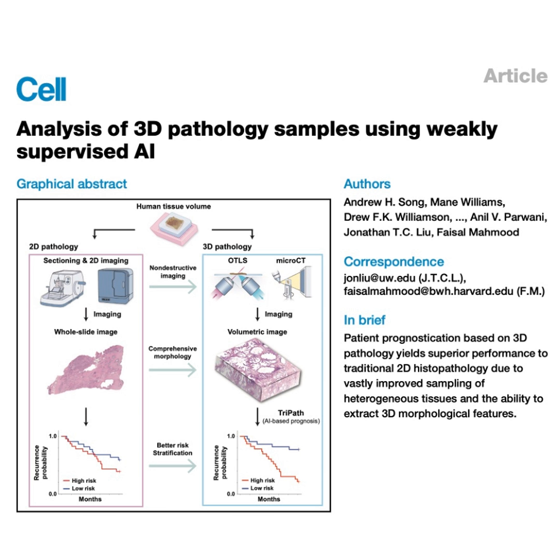Precisely. The attention mechanism automatically learns to assign an importance weight or attention score to each patch. Patches that contain features strongly indicative of recurrence get a high weight. Irrelevant or benign patches get a low weight. So it figures out which parts of the tissue are prognostically important on its own without needing any prior labels pointing them out. It's learning to find the needle in the haystack. Okay, that attention mechanism is the key then. It lets the AI focus on the critical spots within that huge volume, guided only by the final patient outcome. That's pretty smart. It is.